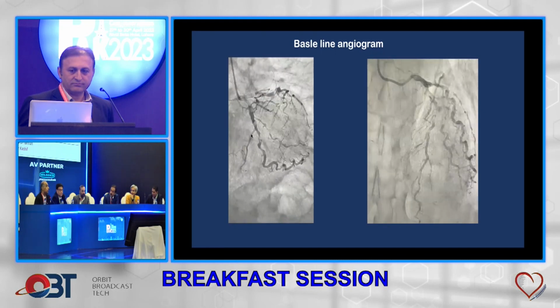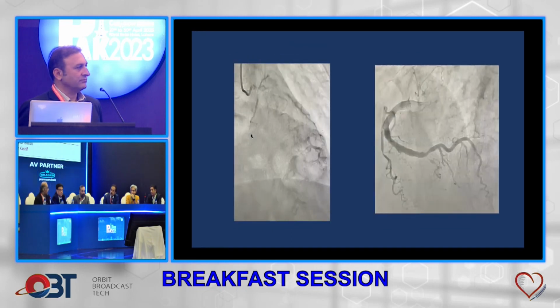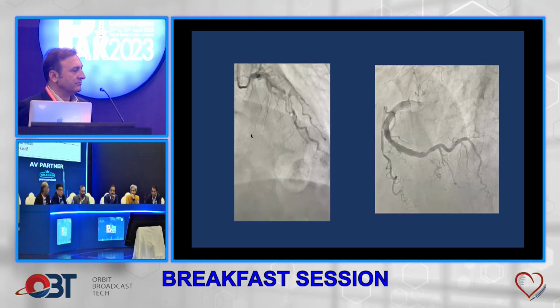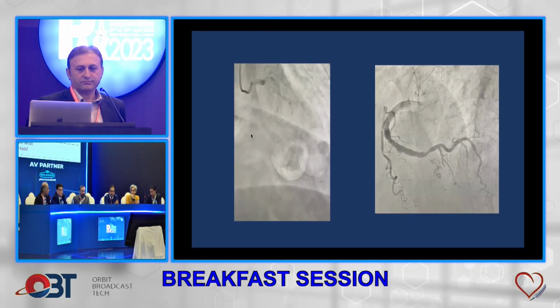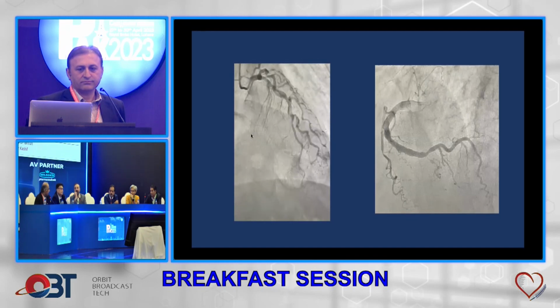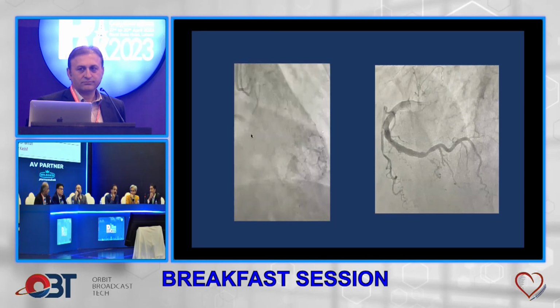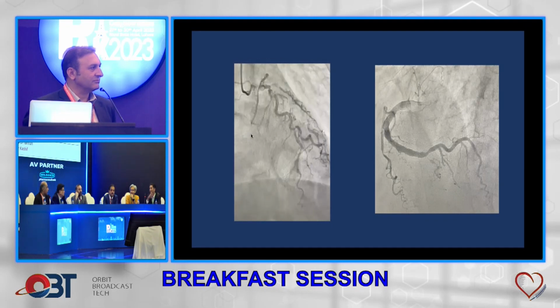Inflate the balloon, you're talking? You have a balloon, bring it as near as possible. Then you inflate, and it's a big balloon now because over here it's a big vessel. So you need to make it central. So you have a balloon of about 2.5 or something like that. Keep it there. It may be your over-the-wire balloon or something like that. This is what the microcatheter will do, and you are making your balloon a microcatheter basically.